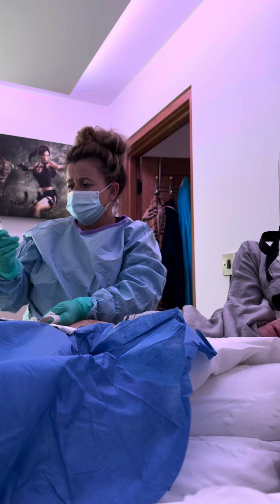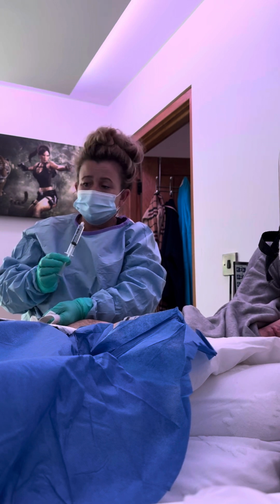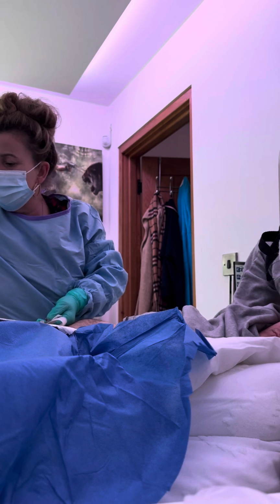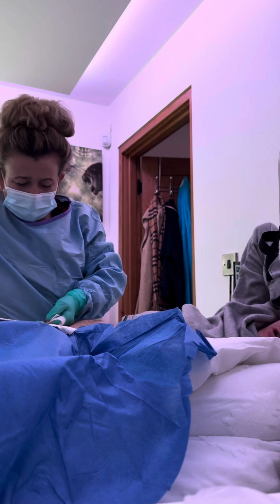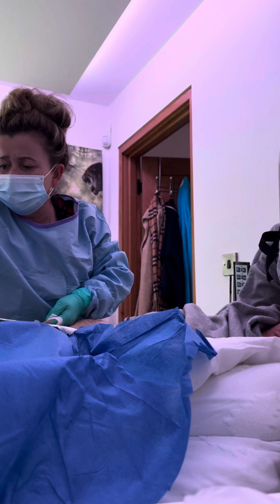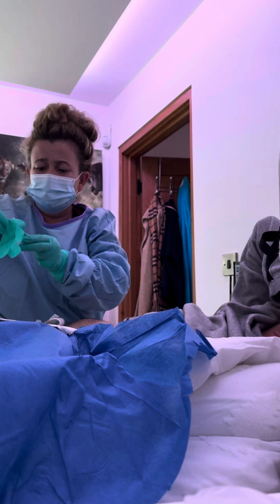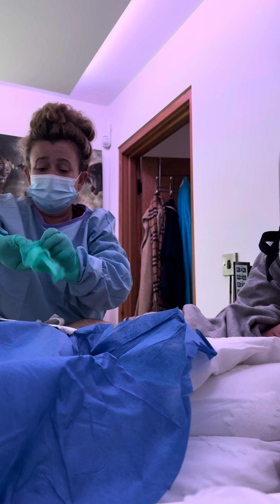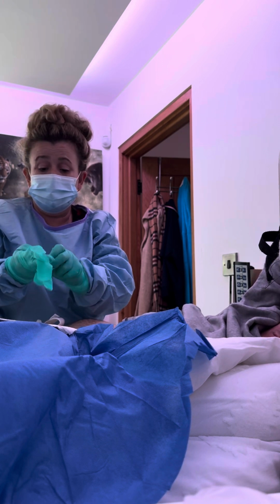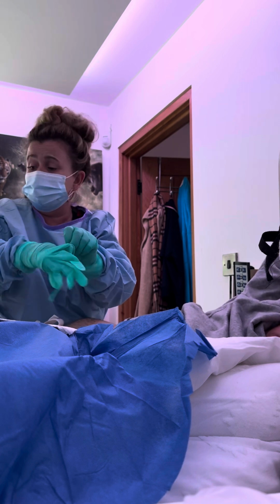It's missing loads. No, it's only missing a mil. What? Yeah, it's only missing 1 mil. So that's not bad. So what I'm going to do now is pop it back in. I've cleaned the area, like I said. I'm just going to try and get a glove on, if I can. If I can't, I'm just going to have to do it without, because sometimes you've got to be really quick at this and you haven't got time for sterilising.